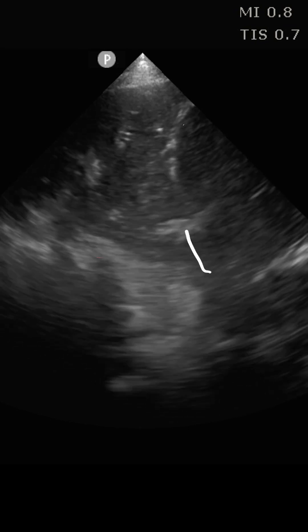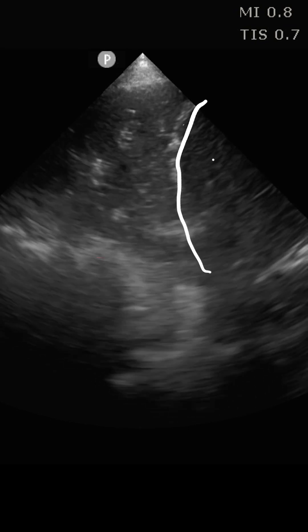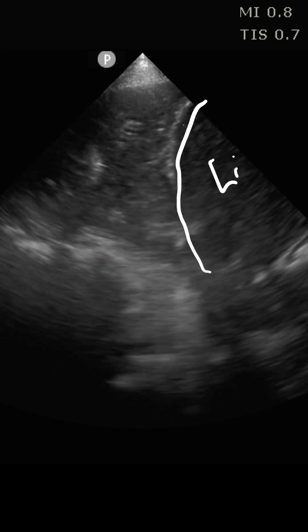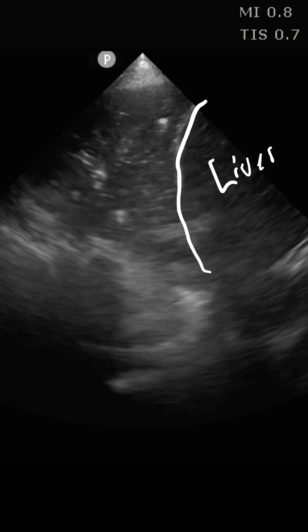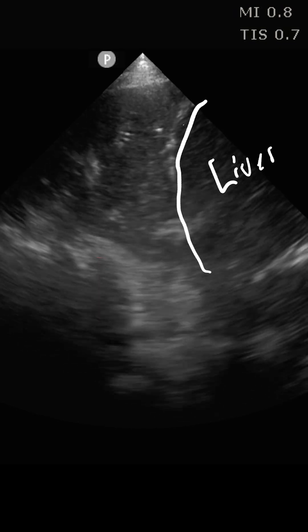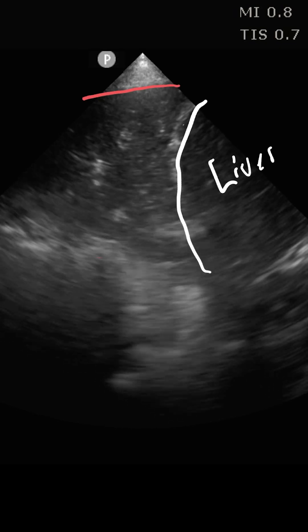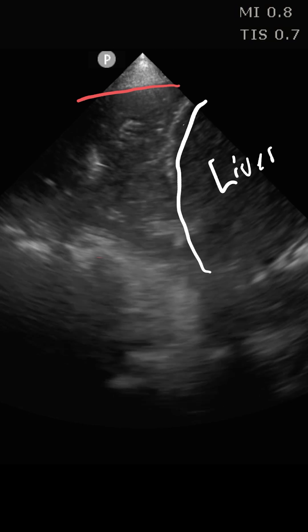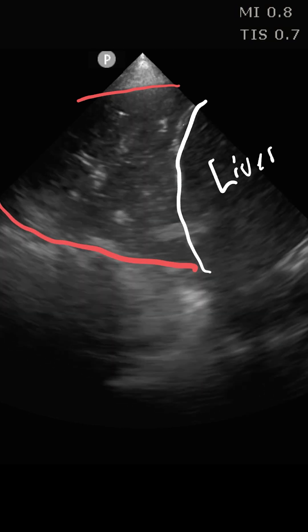This bright white hyperechoic line is the diaphragm, which means everything below it here is the liver. That means everything above it is going to be the lung. The pleural space that we're looking at is going to be right up here and then posteriorly over here.